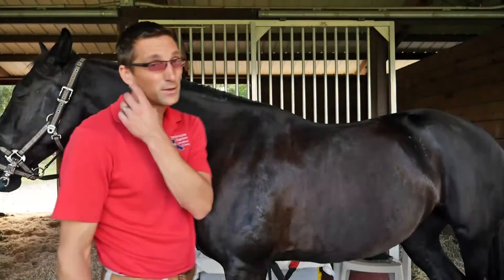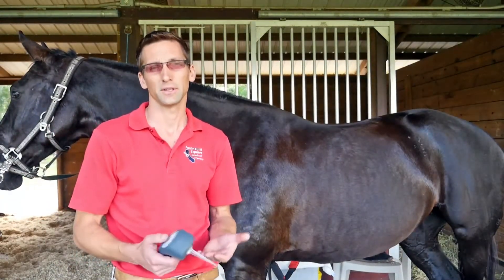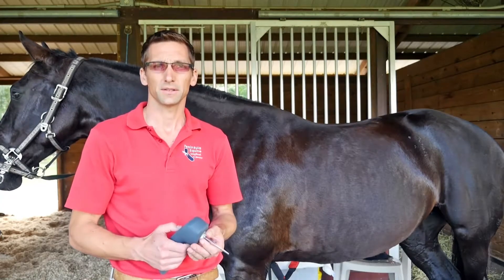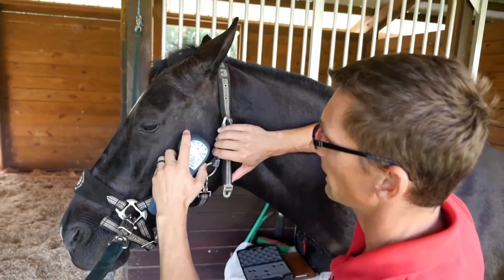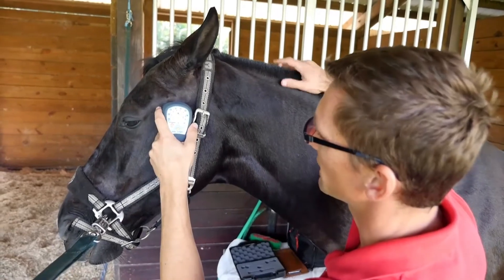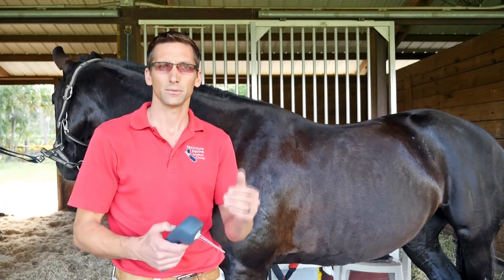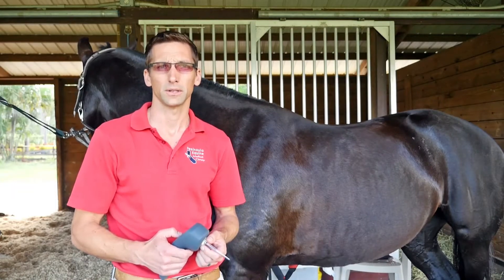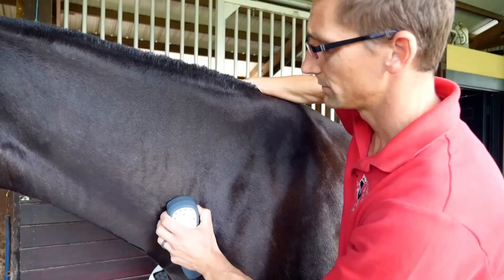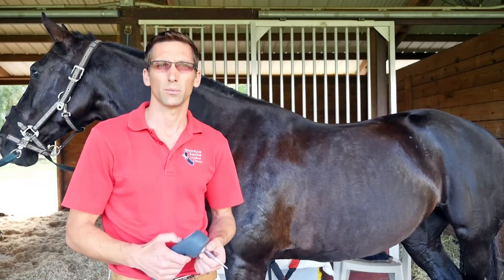I like the Multi-Radiance because of a couple of things. First of all, it's a very safe laser to use, and rule number one is do no harm — so that's very important. But despite the safety, it's quite a powerful laser because it's a pulsed laser. We have quite a high maximum power output while keeping the mean or average power quite low, which gives the benefit of better penetration — important in bigger animals to reach certain areas.